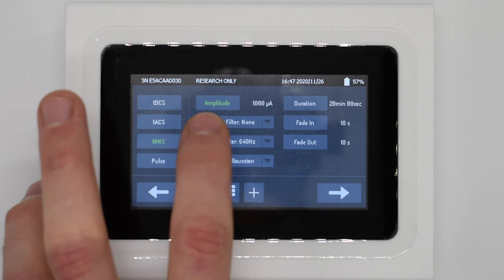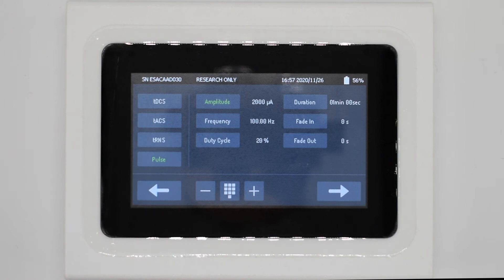The last waveform option is pulse mode, in which we deliver square wave pulses. This mode also introduces a new parameter: duty cycle. Duty cycle denotes the percentage of active signal per signal period. For frequencies higher than 50 Hz, duty cycle is limited between 10 and 90 percent.